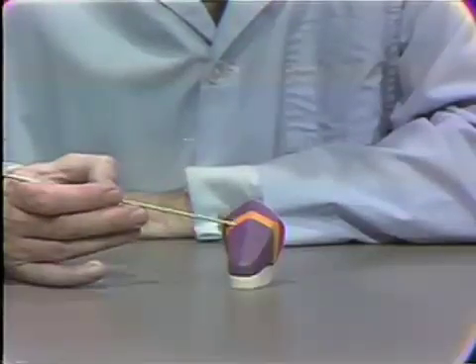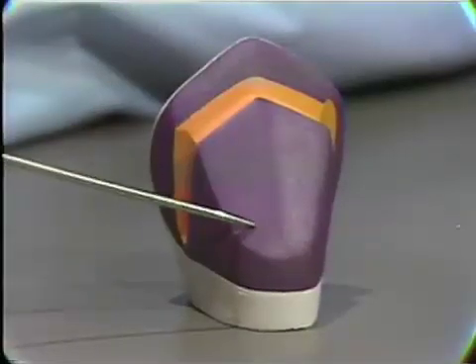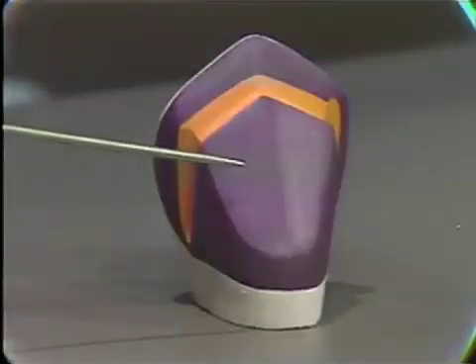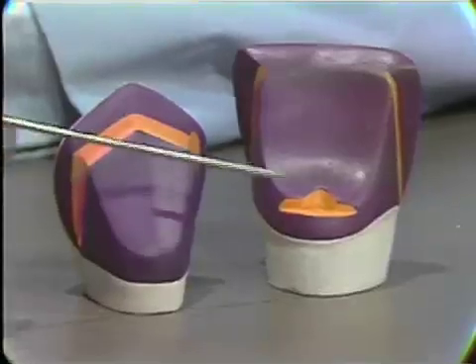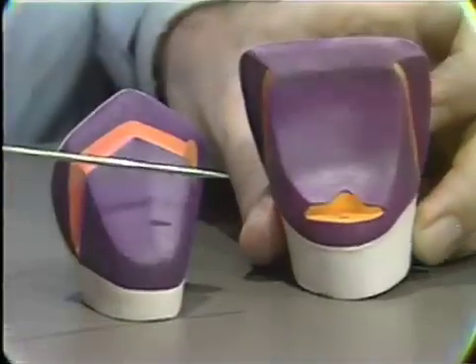When we use such a three-quarter crown for bridge preparation, we usually cut a little recess in here, as you have done, and place a pin in there to give added retention. That type of modification is seen here on a three-quarter crown on a maxillary incisor tooth, where a pinhole has been cut in a little recess at the cingulum area.